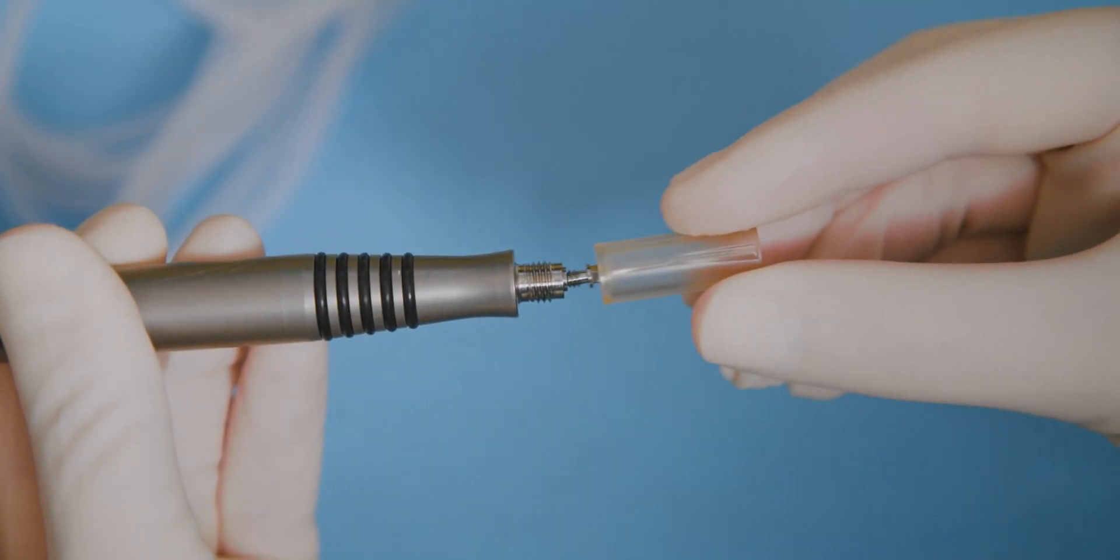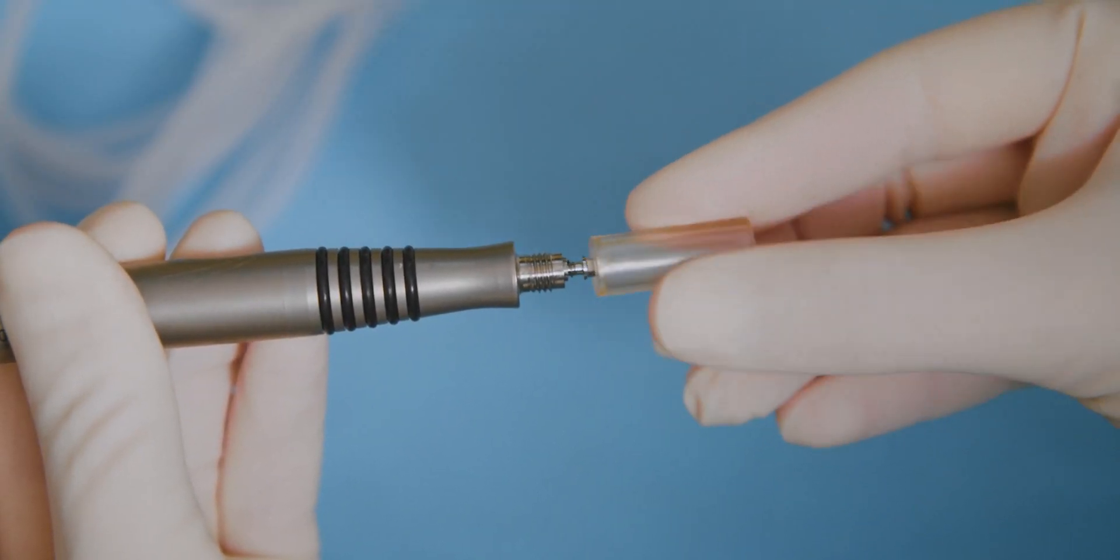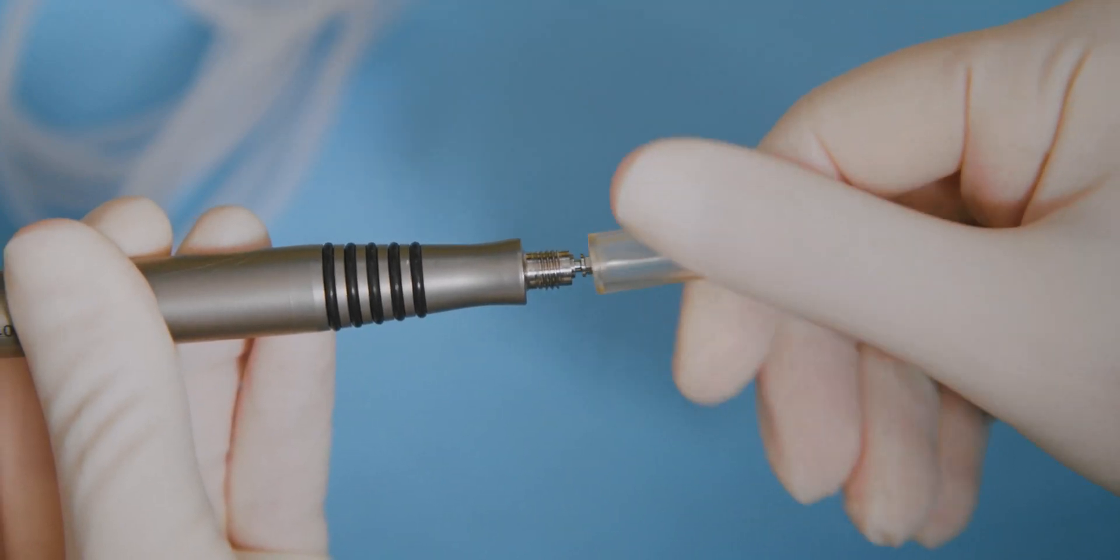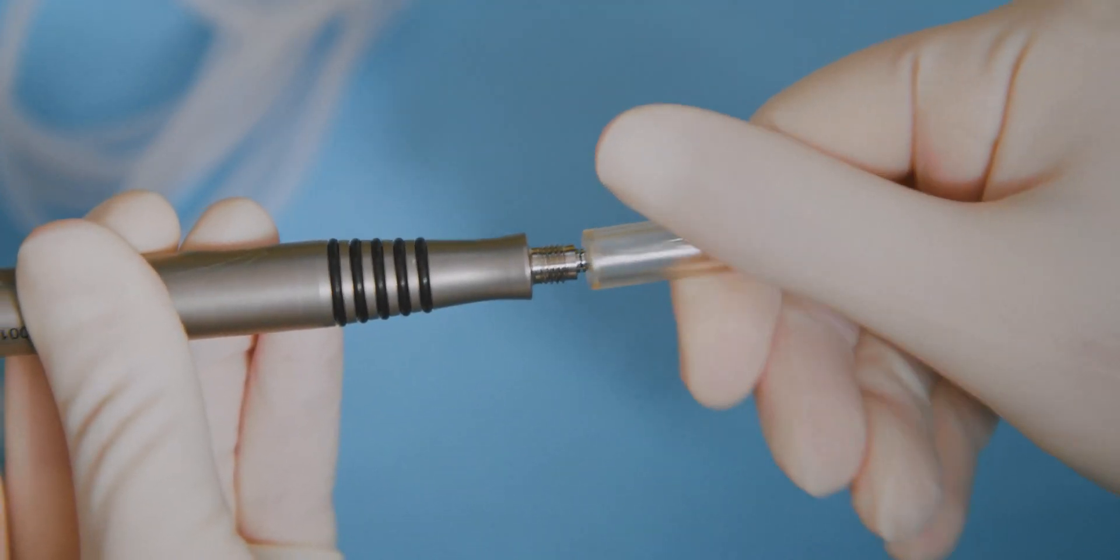Connect the easy FACO tip to the FACO handpiece. Turn the tip gently in a clockwise direction and turn the tip until it locks into position.